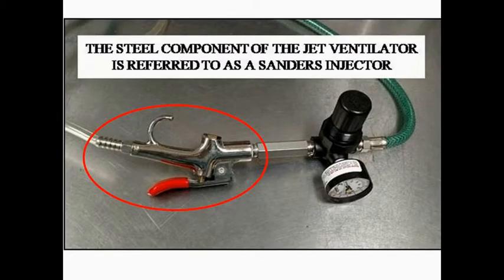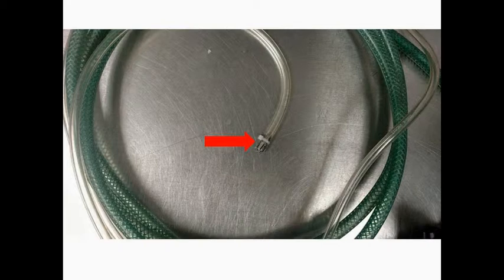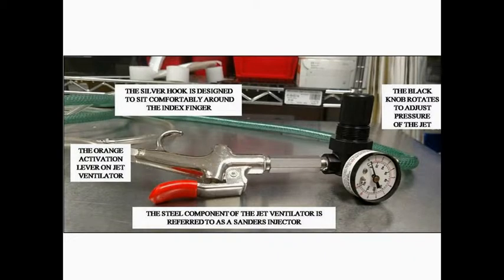Now we will begin a detailed consideration of the use of the jet ventilator, the most important component of which is this metal device called a Sander's injector. The Sander's injector is supplied by green oxygen hose coming from the wall supply at 415 kilopascals or 4 atmospheres pressure. Leaving the Sander's injector is a clear plastic piping which ends in a male Luer lock. If you're going to presume to manage these very challenging cases, you must be intimately familiar with the use of the jet ventilator.